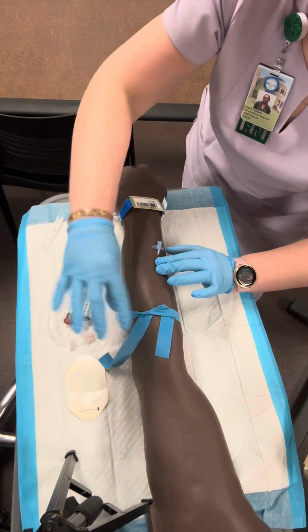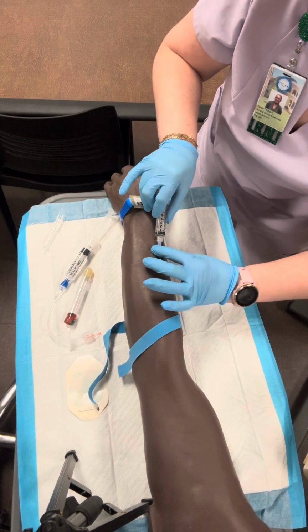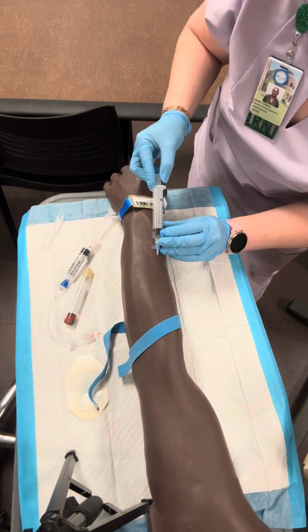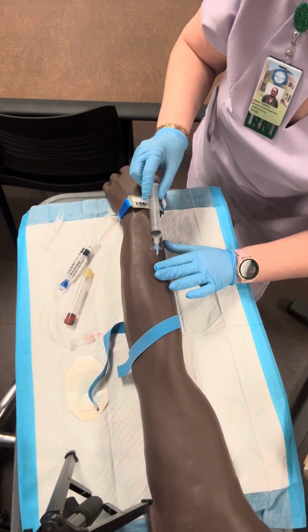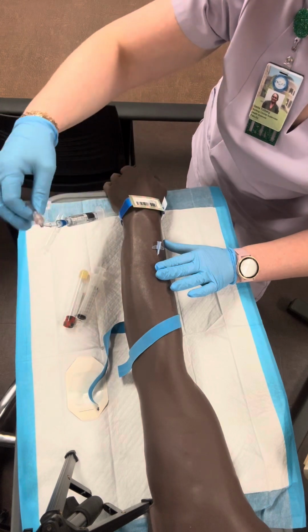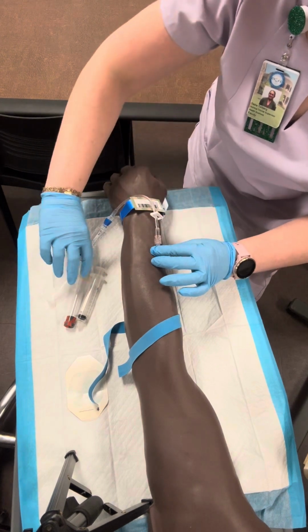Set that off to the side, let go of that tourniquet, grab hold of my syringe, set it on, twist, twist, twist, pull back. All right, I have the appropriate amount of blood. Going to loosen it up, hold pressure, set that off to the side, grab my extension tubing, attach that on.